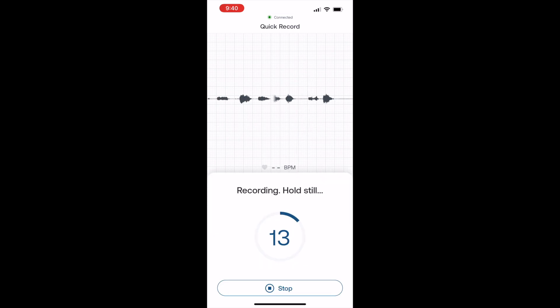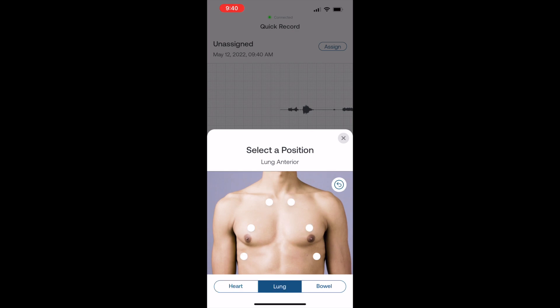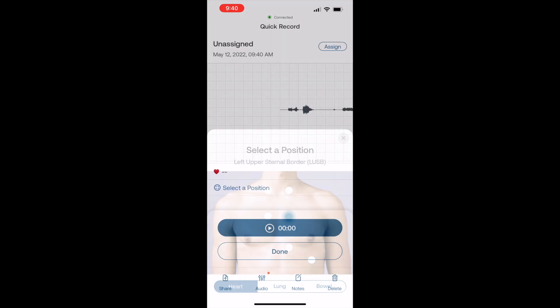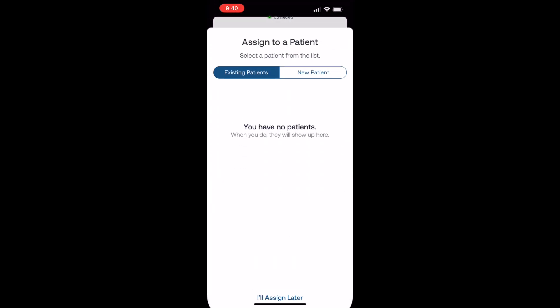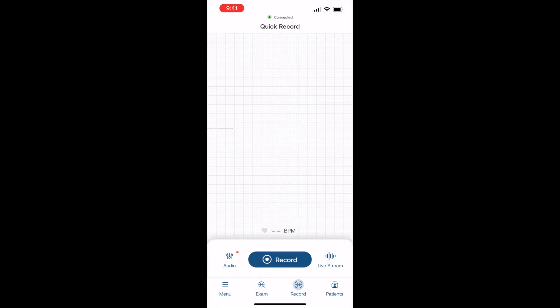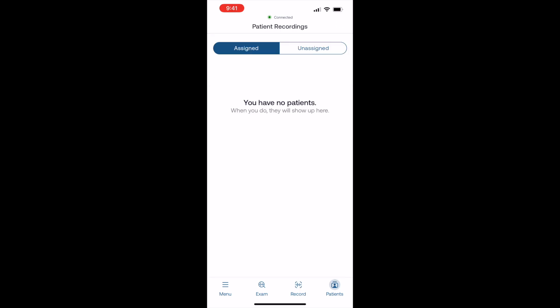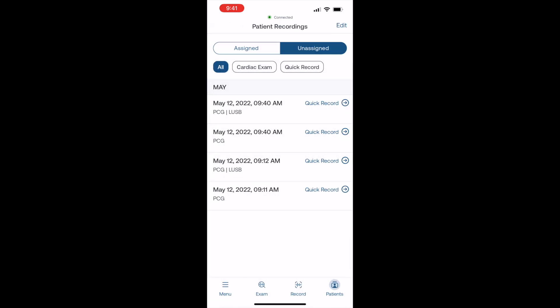Hit record — it's going to record for a few seconds. I can put this to my chest. Once it saves, I can select a position for what I was listening to, whether it be heart, lung sounds, or bowel sounds. I can note whether the patient was standing, sitting, or supine. And then I can assign it to a patient if I need to and put in their information. If not, I come out of it and hit done. Then whenever I want to re-listen, all my recordings are there. Definitely a really cool feature.